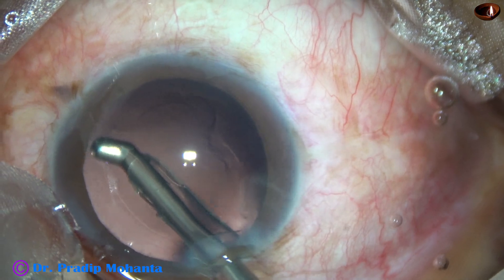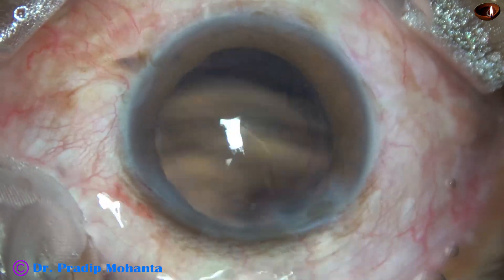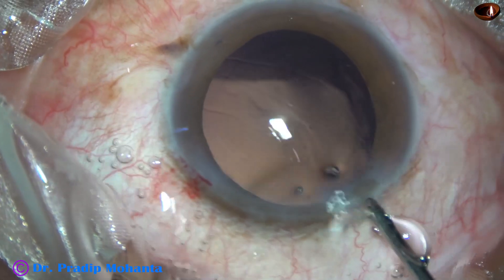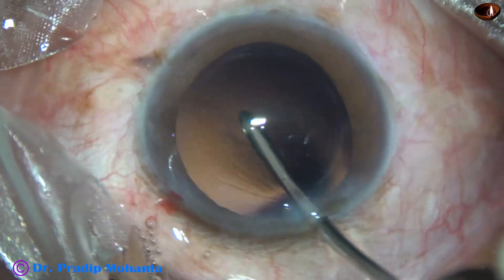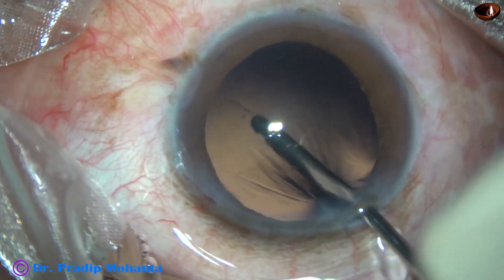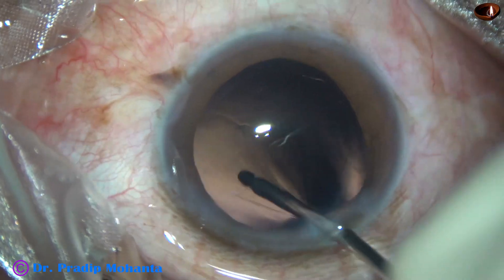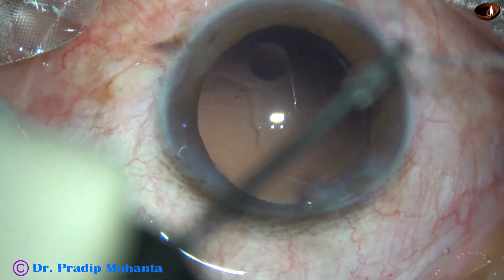It doesn't matter where you start. We can also start from the sub-incisional area and remove the rest. Now this is polishing of the posterior capsule with the irrigating probe only, without using the aspirating probe.